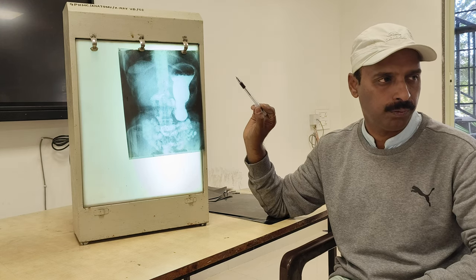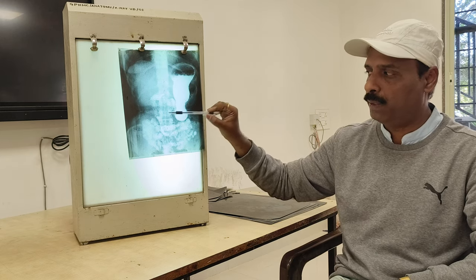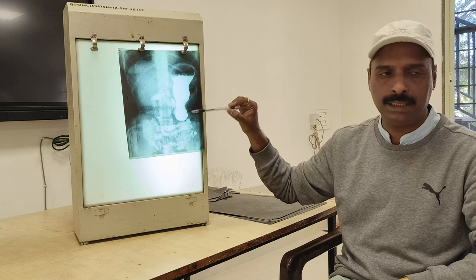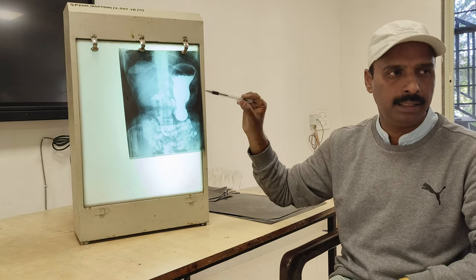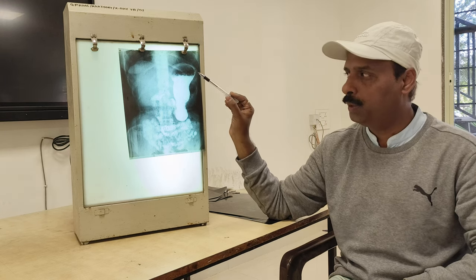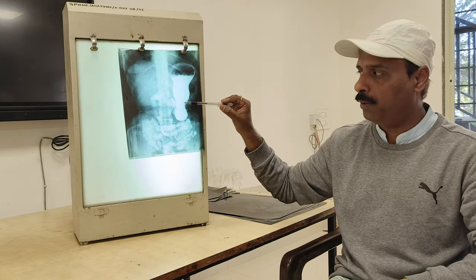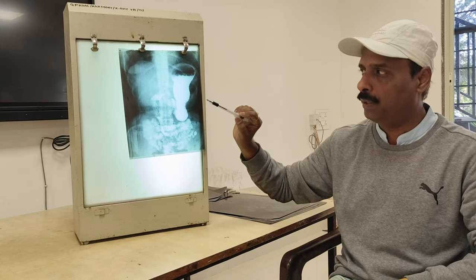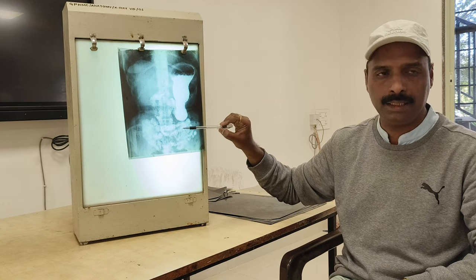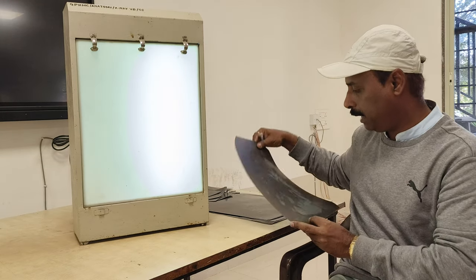Here we get the duodenum to the ileocecal junction, and then we call it a barium follow through. Okay, you also have to mention the other structures: the vertebral column, ribs, and domes of the diaphragm above. All that is included. But mainly you have to highlight that it is a contrast variety of x-ray, barium meal x-ray, barium follow through, which gives all the shadows: the fundus, the body, pyloric antrum, pyloric canal, and the duodenum also. This is the small intestine when the barium meal has entered. This is a special contrast variety of x-ray.